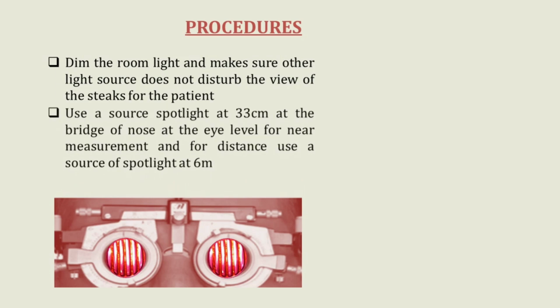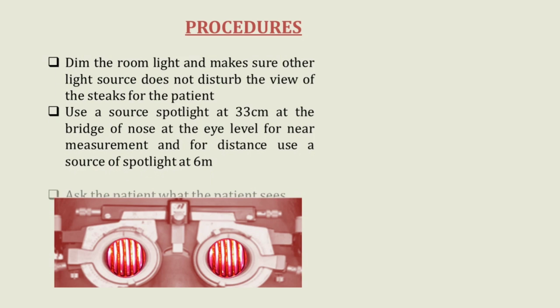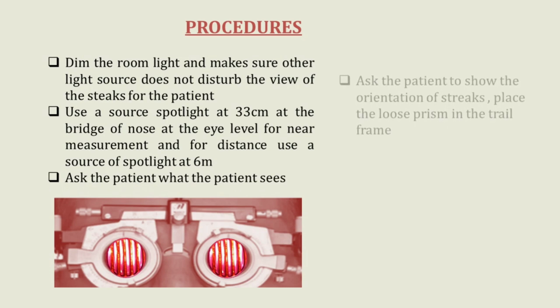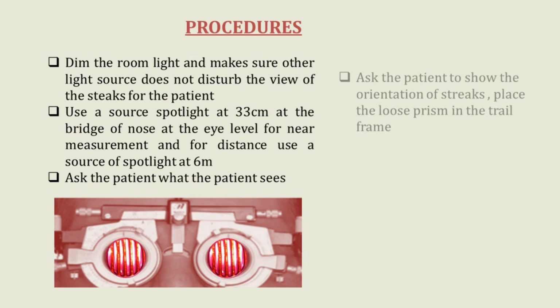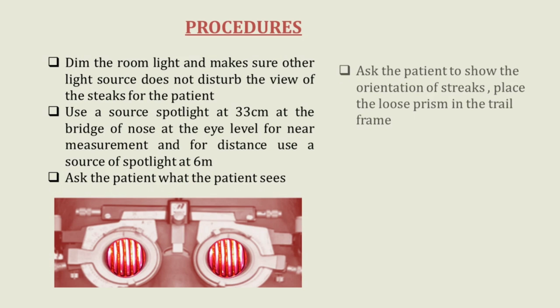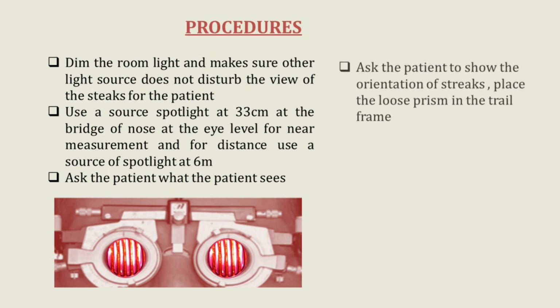Ask the patient what they are seeing on the double Maddox rods, which you can see in this picture. Ask the patient to show the orientation of the streak, and then place the loose prisms in the trial frame.